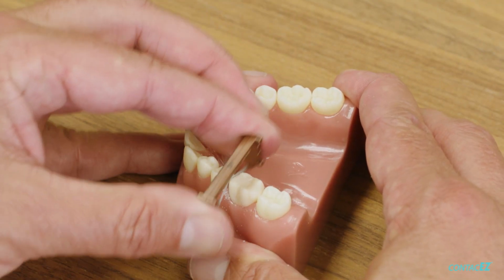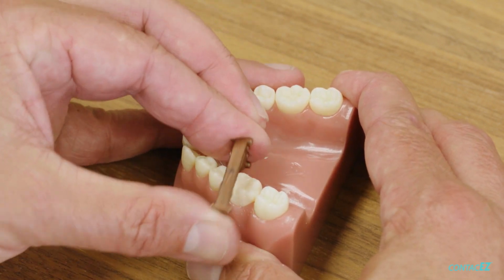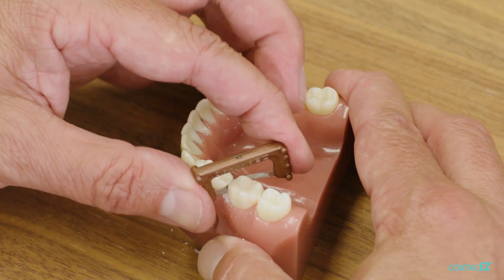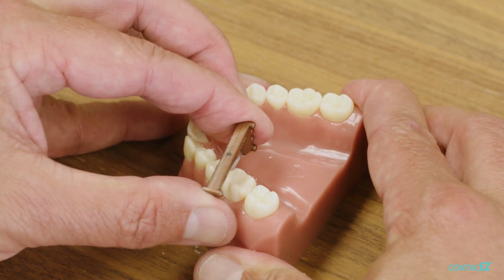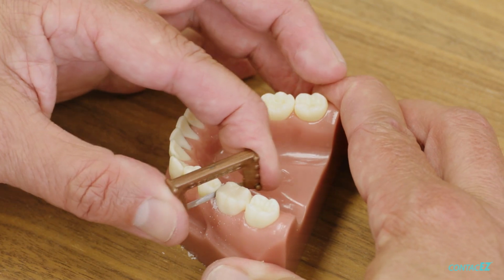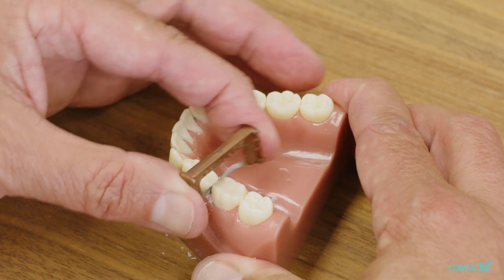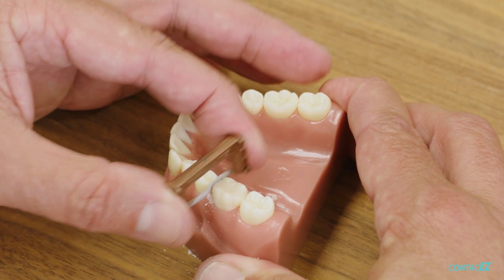I was in Dr. Kim's office yesterday and watched him using these strips to put bevels on direct composites, and it's kind of his all-purpose abrasive for being able to go in and either polish or trim or shape things. And it kind of opened my eyes that, oh, there's a lot of different ways you can use these strips once you have them interproximally. He was actually using them on the incisal edges of some maxillary anterior composites that he was doing.